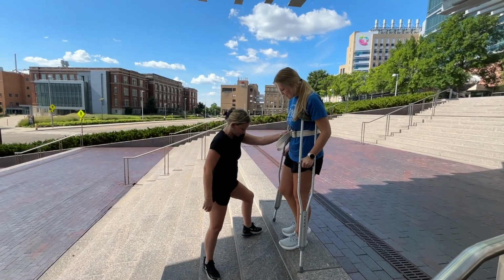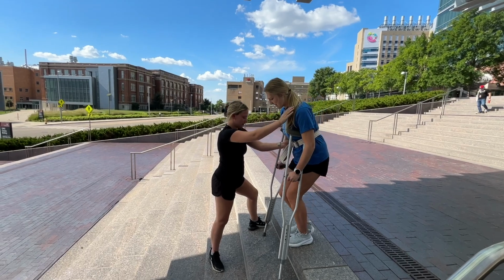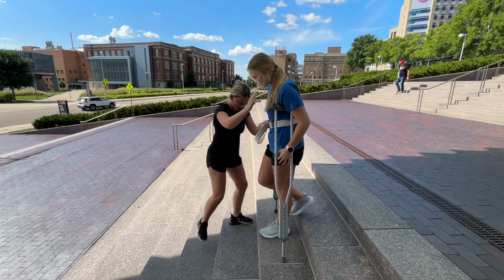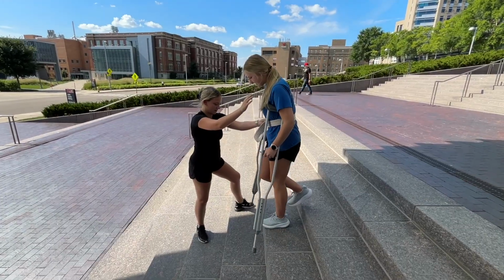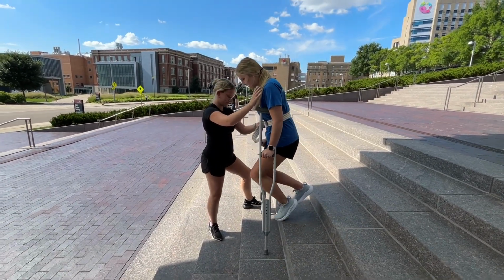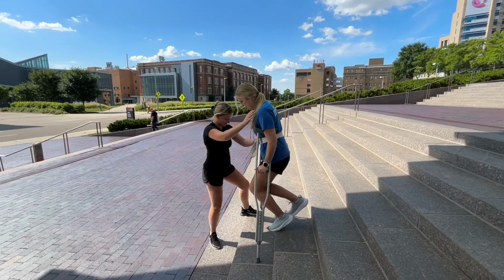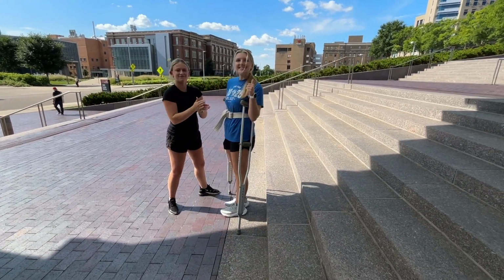To descend a curb using bilateral crutches, the patient places the crutches down onto the lower surface by slightly flexing the stronger hip and knee. The patient steps down using the stronger lower extremity after the crutches and the partial weight-bearing extremity resting on the lower surface. While the patient is moving, the PT should be walking in front of them on the same side as the injured extremity, with one hand on the patient's gait belt and the other hand over their opposite shoulder from the side you are at.